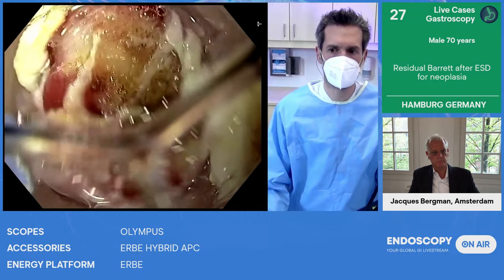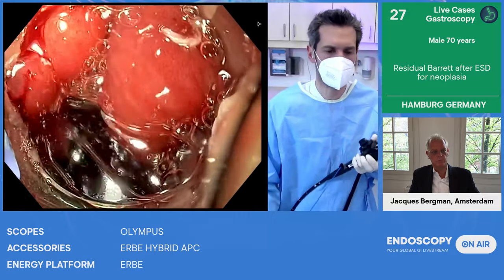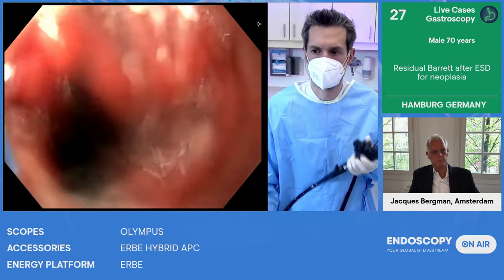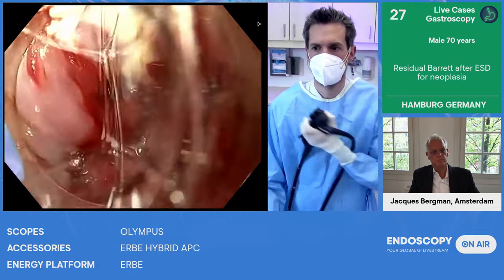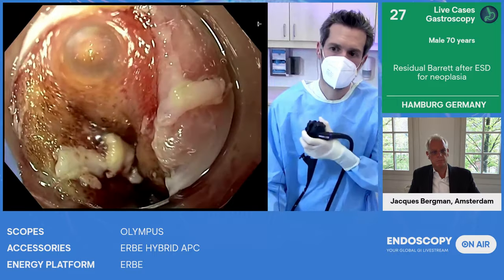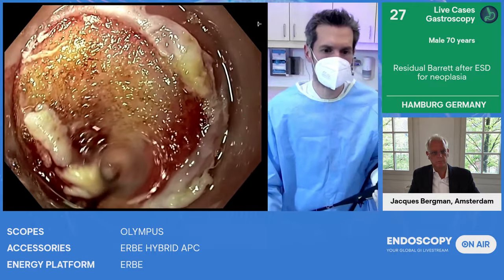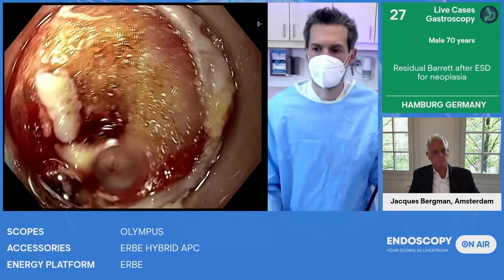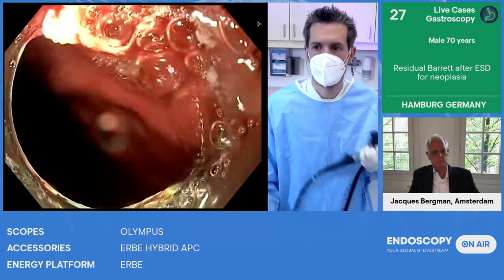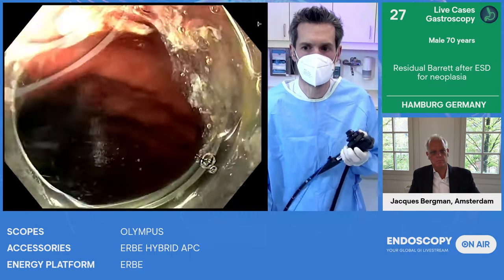We do not always use the hybrid APC. You can also use a needle to inject and then use a normal APC probe. This is also possible, especially in small areas like this. So, okay, I think, as you said before, the area seems to get bigger every time you do an ablation. And so I think now that's good enough for the second round. And I'm finished with this part, and I'm going to hand back to Thomas for the ESD.